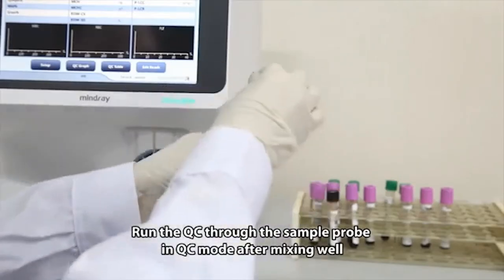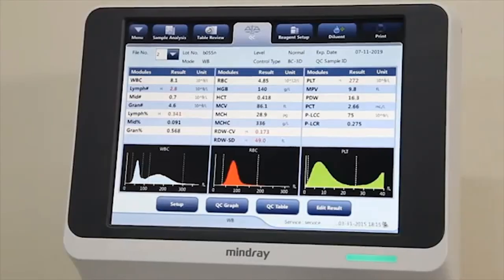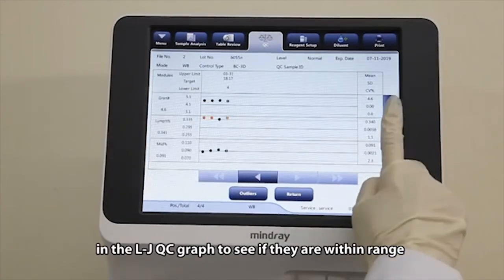Run the QC through the sample probe in QC mode after mixing well. You may review the QC results in the LJ QC graph to see if they are within range.